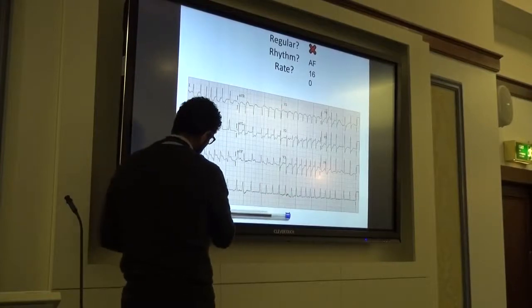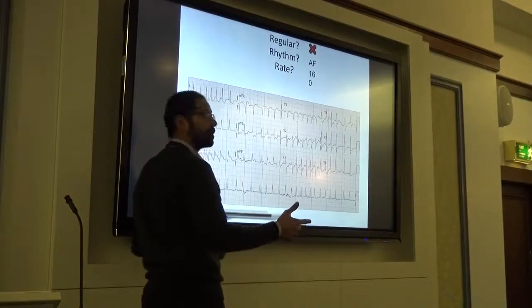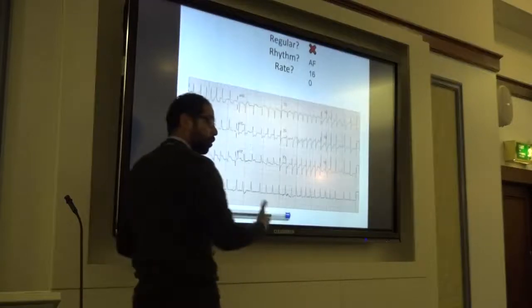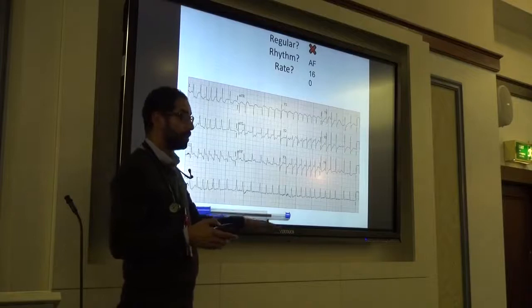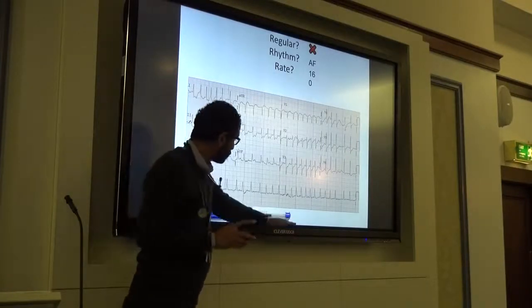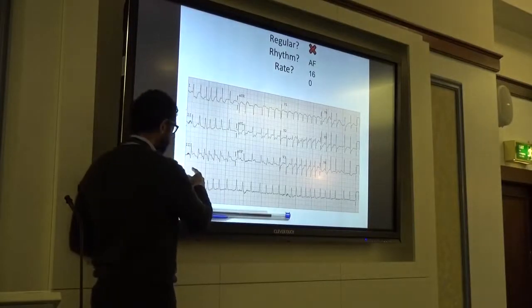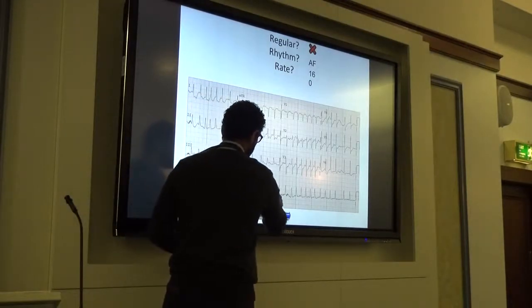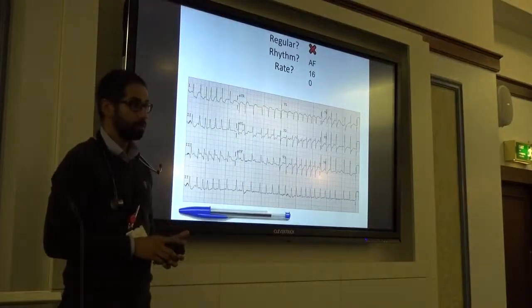You can count 1, 2, 3, 4, 5, 6, 7, 8, 9, 10, and so on, and then someone pulls you away, and you look up and think, where was I, and you start counting again. One of the tricks that I picked up is that if you drop a pen, it usually lands on 30 squares. I don't know how it does it, but it does. So you just drop a pen, it usually lands on 30 squares, and then you start counting 1, 2, 3, up to 16. Usually it will give you the rate that you're looking for.